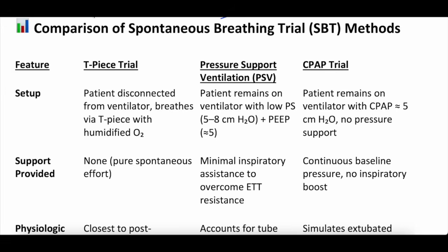Because this table here is kind of a comparison of spontaneous breathing trial methods, including the T-piece trial, pressure support trial, and CPAP trial. And just going with setup, right? For a T-piece trial, the patient's literally disconnected from the ventilator and hooked up to humidified oxygen. For the pressure support trial, the patient remains on an inspiratory pressure and a PEEP. And for a CPAP trial, the patient just remains on PEEP.